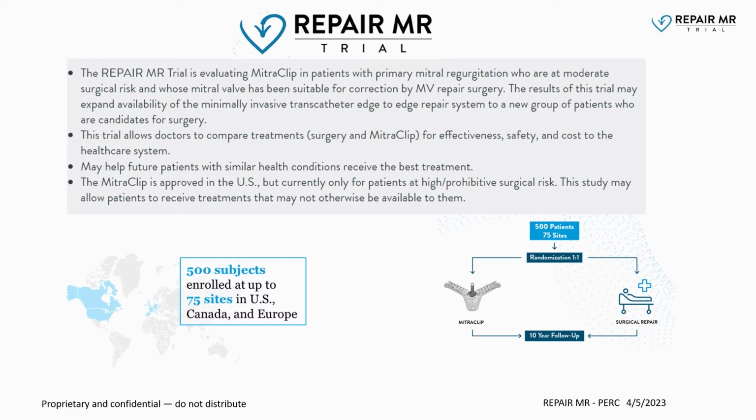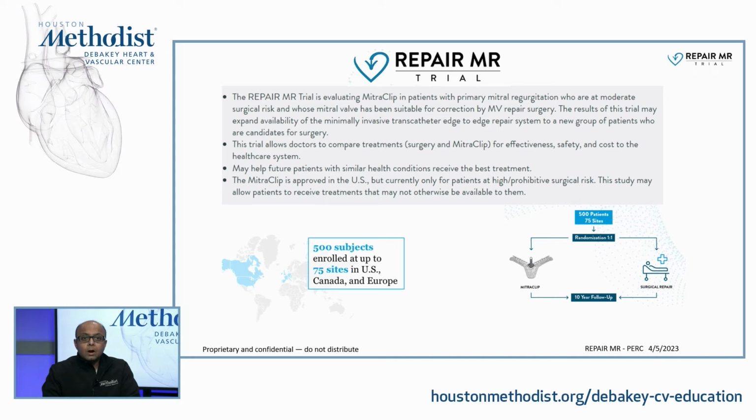So I'm going to talk for a couple minutes about the REPAIR MR trial. This is a trial that we are enrolling here at Houston Methodist. This is evaluating MitraClip in patients with primary or degenerative MR who are at moderate surgical risk and whose mitral valve has been deemed to be suitable for correction with surgery as well as MitraClip. And this is now expanding into the intermediate risk or the medium risk patients.